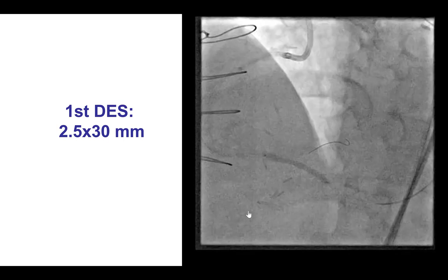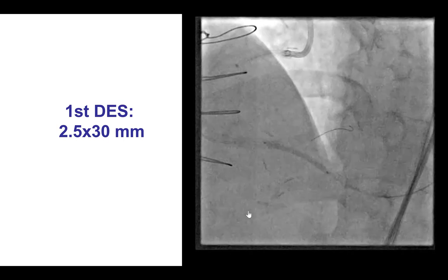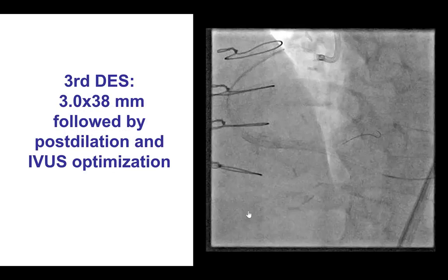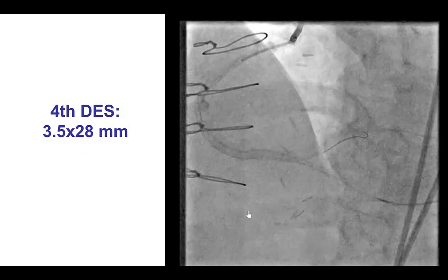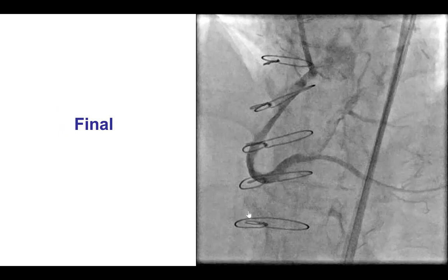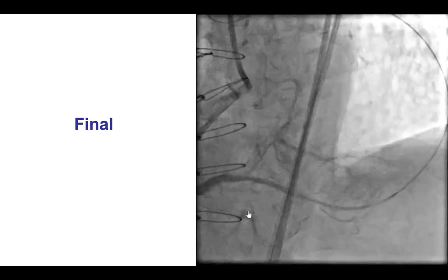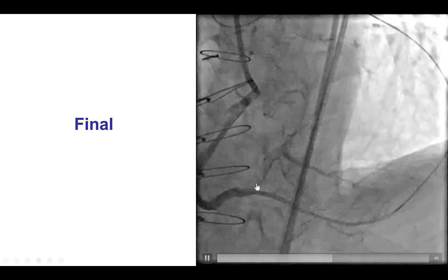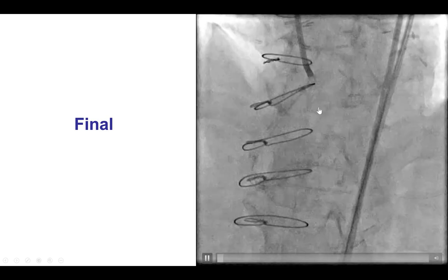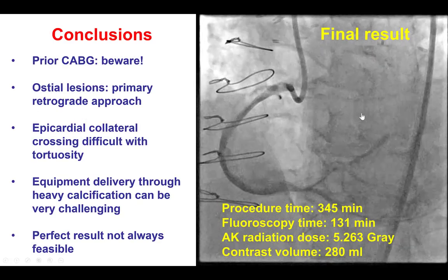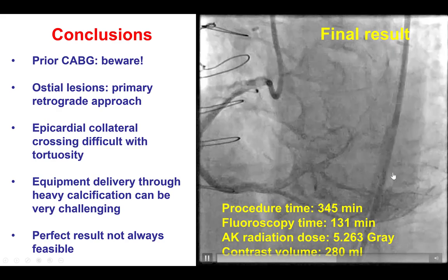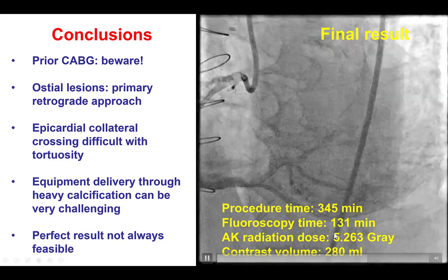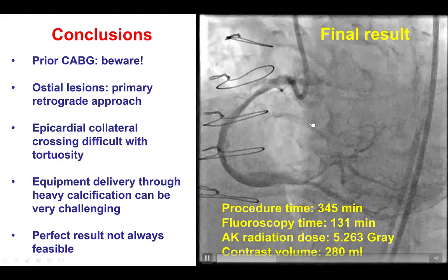As a result, after a long time, we decided to proceed with stenting, securing the PDA. We placed four drug-eluting stents all the way from the PDA to the ostium of the right coronary artery. We used IVUS to optimize the stents. There was of course significant calcification, and this is the final result. We did have flow into the right coronary artery all the way to the PDA. There is some subintimal dissection and some flow into the right posterolateral which is not optimal, but given that it had been a very long case with 131 minutes of fluoroscopy and 5.2 gray of radiation, we had to stop at this time.